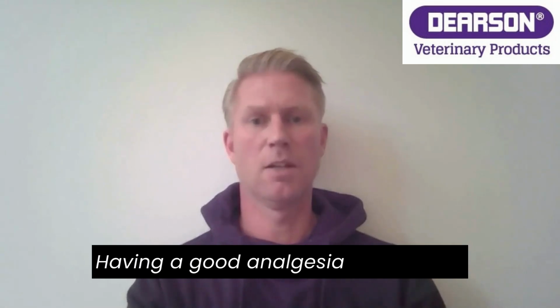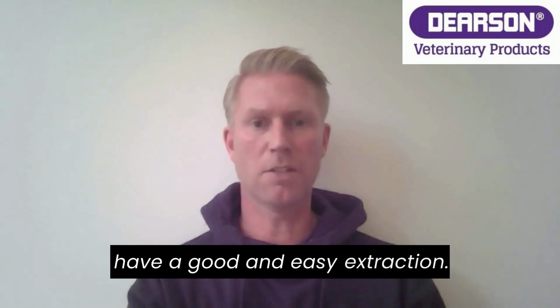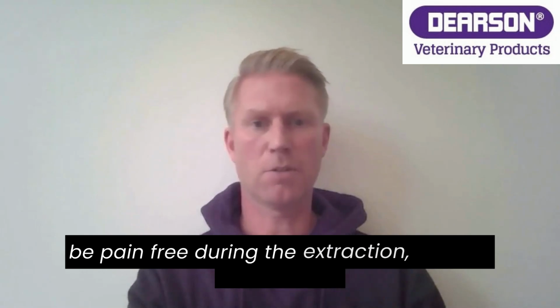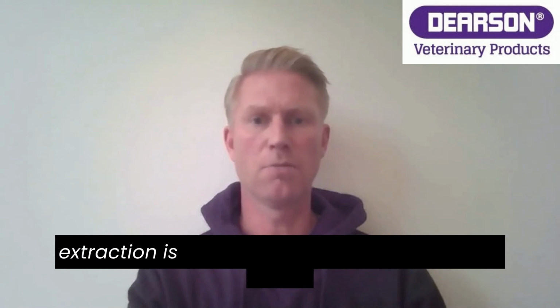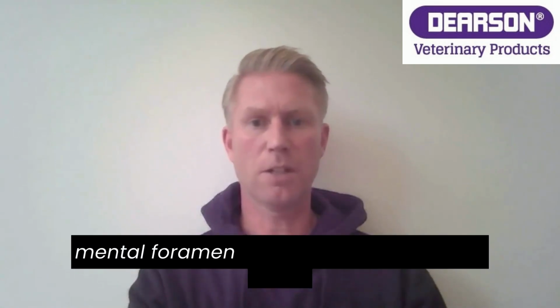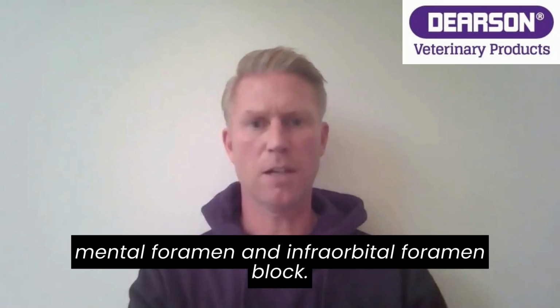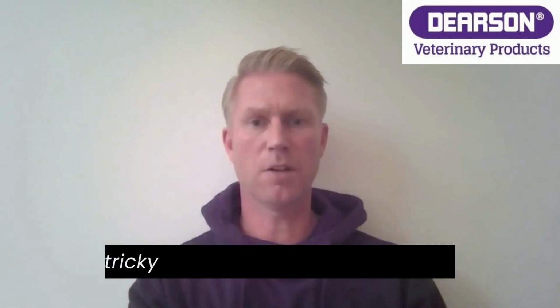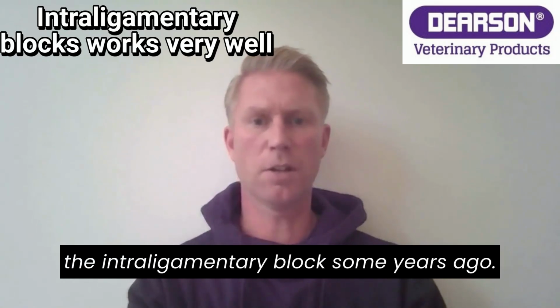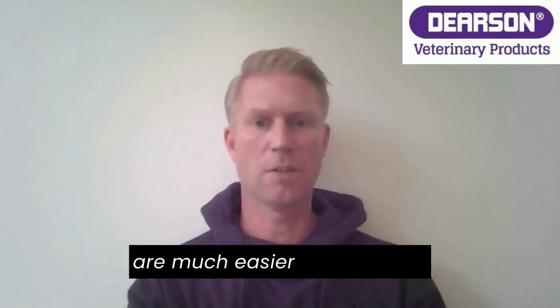Having a good analgesia is crucial to have a good and easy extraction. This is, of course, because you want the horse to be pain-free during the extraction, but also because the extraction is much easier if the horse doesn't move. For many years, I have used the mental foramen and infraorbital foramen block. I have always found these blocks a little tricky, and that is why I changed to the intraligamentary block some years ago. These blocks work very well and are much easier in my hands.